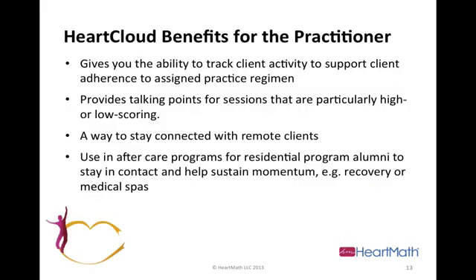A lot of benefits for the practitioner. You can track client activity to support their practice. It can also give you talking points. Are they having a particularly high or low scoring session or day? For those who work with clients remotely, it allows you a way to stay connected. And we think it's going to be great for aftercare programs for residential program alumni to stay in contact and help sustain momentum. For example, recovery, addictions, eating disorder clinics, and also medical spas.